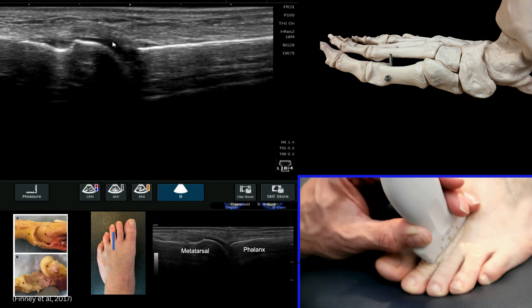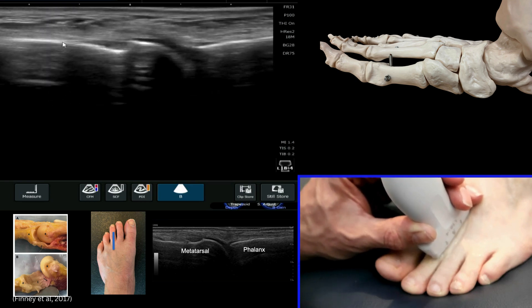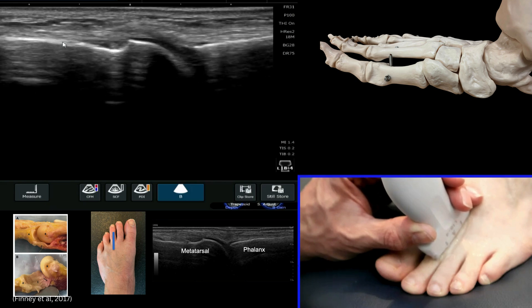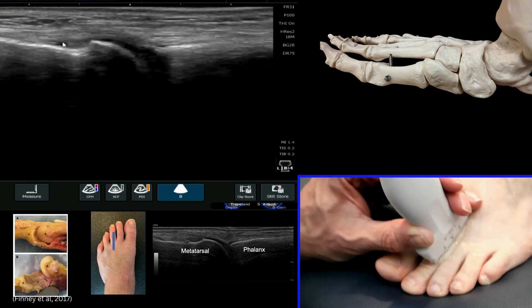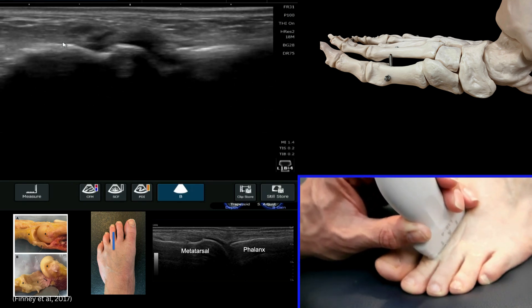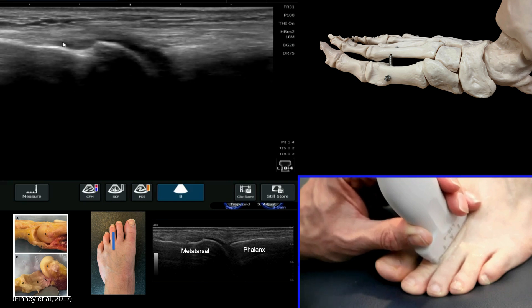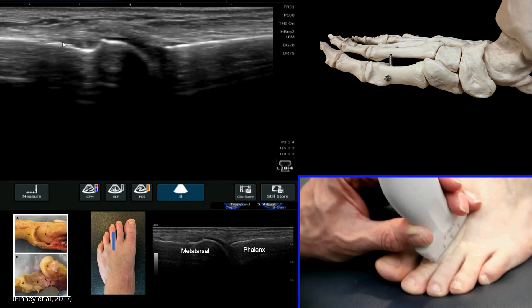This black line is not fluid — this is articular cartilage — and often there will be a normal notch here on the dorsal aspect of the distal aspect of the metatarsal shaft. You can continue to have a look all the way through that joint from its most lateral to its most medial aspect, and that's important to do. The same approach can be used for all of the metatarsophalangeal joints across this region.